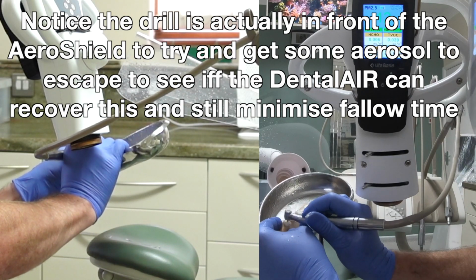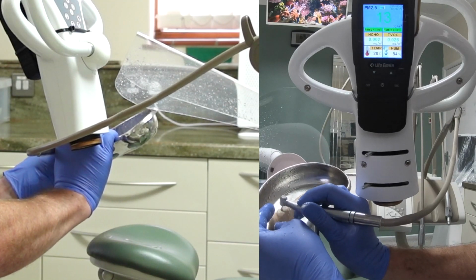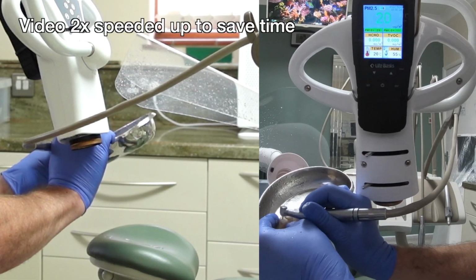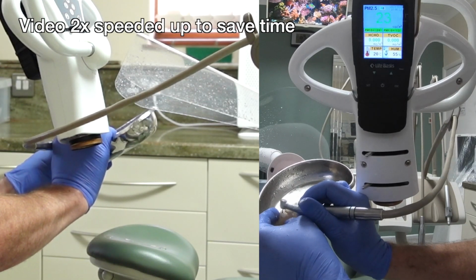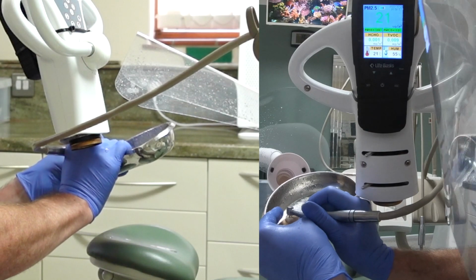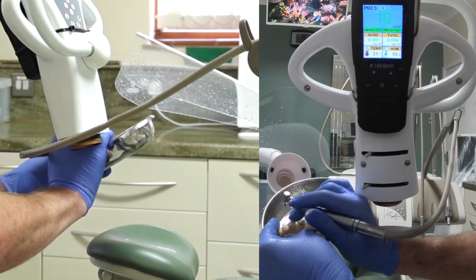Really trying, going for a while. Okay, well, I'm pulling this forwards a little bit. Sort of a little bit of an unrealistic circumstance here. Water dribbling everywhere, but I'm going to try and get something. Bring some more yogurt in there as well. Almost pulling the model away from under the aerosol. We are getting a few readings. A bit more yogurt in there.